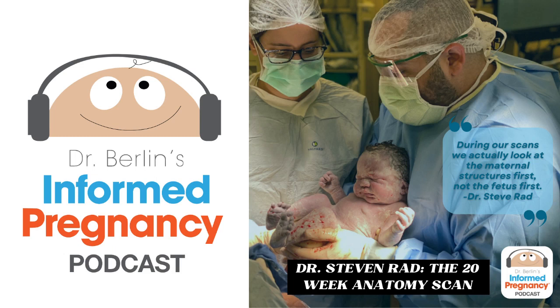Are there sometimes that it's done deliberately earlier or later? Yes. So it's an excellent question. What is up and coming in maternal fetal medicine is called the early fetal anatomy scan. Now, about 5 years ago, a lot of the MFM started to realize the machines got better and our experience got better and our visibility got better on ultrasound. Starting around anywhere from 11 to 13 weeks, we could start to see some of the fetal anatomy really beautifully, and especially by like 15 and 16 weeks.